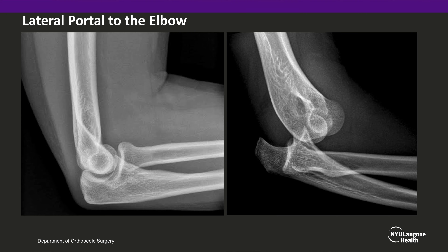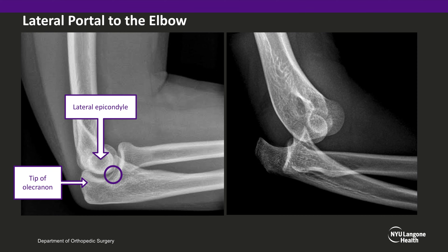Here we have two lateral x-rays of the elbow demonstrating the location of the hematoma block. In the non-dislocated elbow, the hematoma block will be performed in the lateral soft spot of the elbow, between the tip of the olecranon, the lateral epicondyle, and the radial head. These can be palpated easily on most patients and guide the placement of your needle.